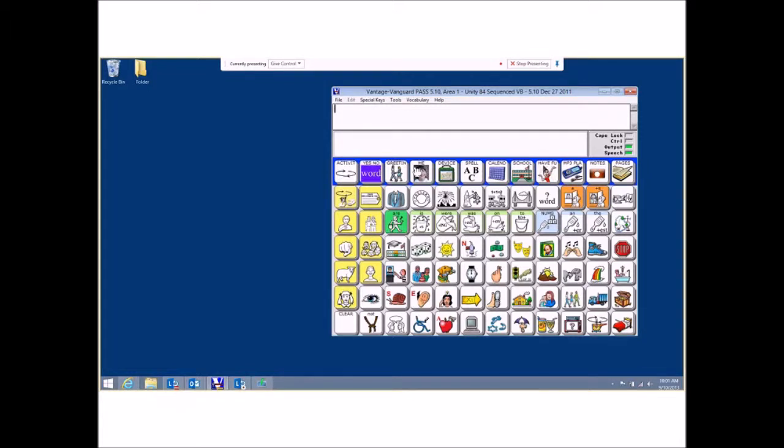I copy it on here pretty regularly. So if you have any questions, feel free to email me, and I'll be happy to tell you where something is or how to turn something off or on or whatever you might need. There's really very little reason to customize the device. Everything that he needs to be able to say, he should be able to say off of this one screen. But if there is something that needs to be added, please feel free to send me an email or give me a call and let me know, and I will be happy to talk to Jake. We like Jake to have ownership of the device, so if something needs to be added, I'd like for him to select where it would be added so that it would make sense to him as he's using it.